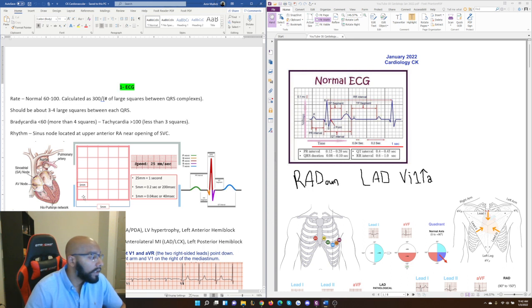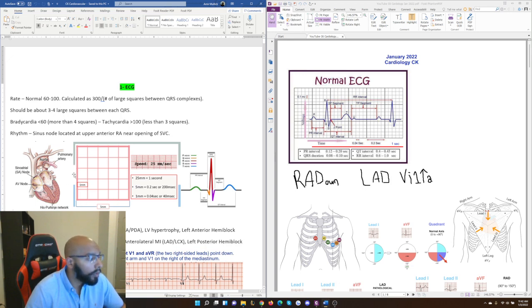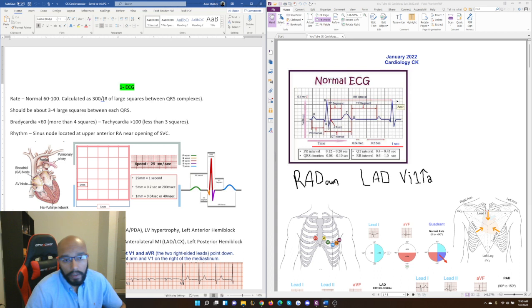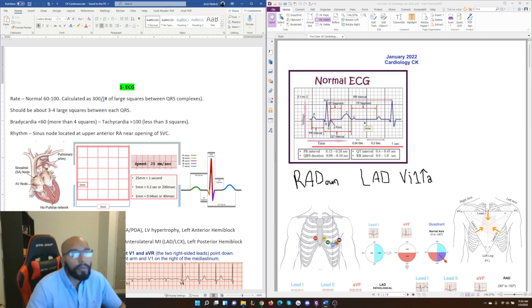Each little square is 0.04 seconds. Five little squares together make one big square; one big square, which is five millimeters in length, equals 0.2 seconds. Five big squares together give you one whole second. This lets you estimate heart rate in your mind without too much calculation.